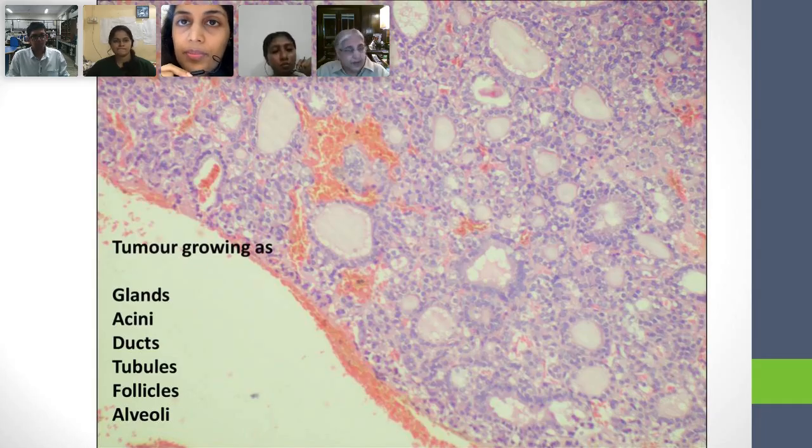It doesn't occur. Are you getting the concept now? Okay. Yes. All right. So first of all, it has to be small. Now here, there are some very small structures, and how do we know that this is not a gland? But this is not an acinus. You are not likely to get so many crowded and such large acini even if it is growing in a tumor. So the size is wrong in this case for an acinus.